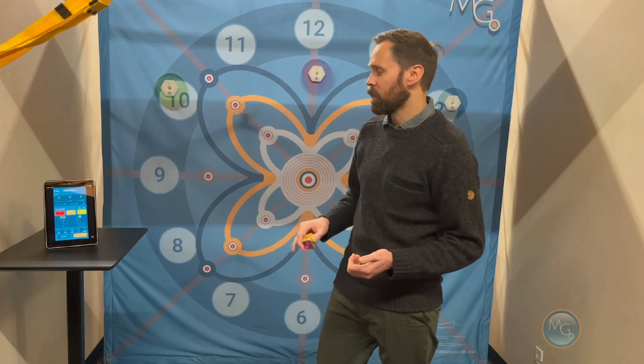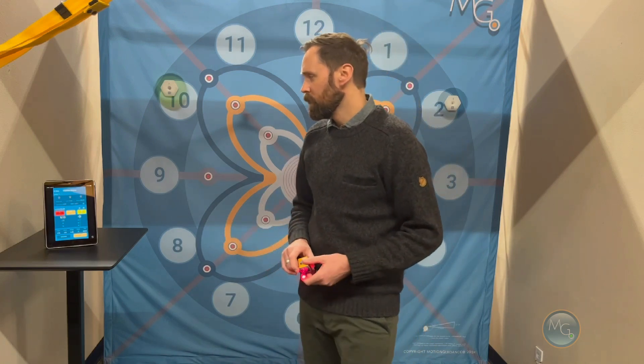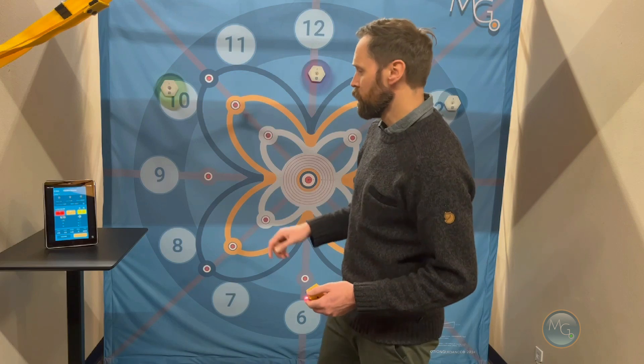Beyond working on motor skill training or reaction time training, the Motion Guidance interactive system can also do really cool things for training cognitive function. On the interactive app, we've got a lot of different games and I'll demonstrate just one of them — a sequence memory game.